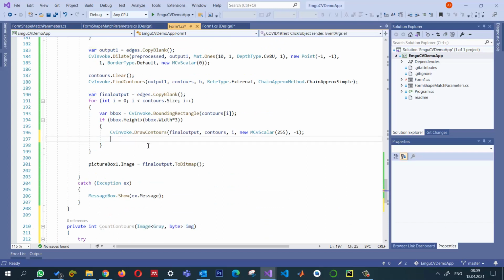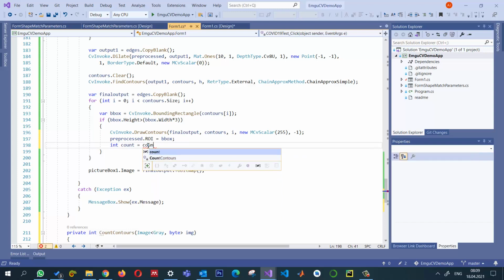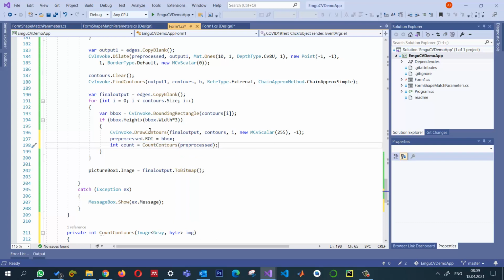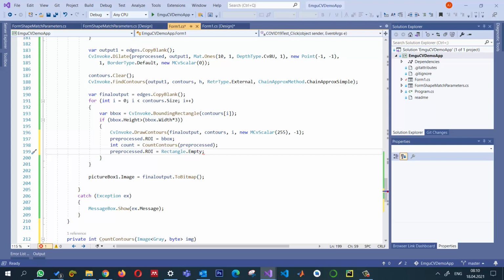Before calling it, what I am going to do here, the pre-processed image.ROI. This is very important. And this will be the bounding box. This means that I am only processing that cropped area. And then we can use this integer count is equal to CountContours method, and inside this I'm going to pass this pre-processed image. It's not the whole image, so it will be only processing this ROI region. And don't forget to reset to original contour right after using it. So I'm just going to set it to be Rectangle.Empty. So it means that we just removed that contour. We processed it and then we did it.